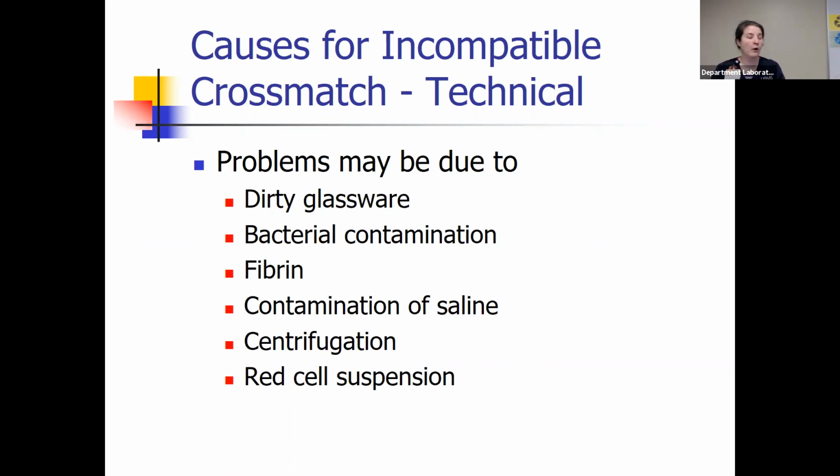Centrifugation, if you over centrifuge, okay, that could cause the cells to be firmly packed and then you might not shake hard enough to get your true negative result. And then red cell suspension, all right?